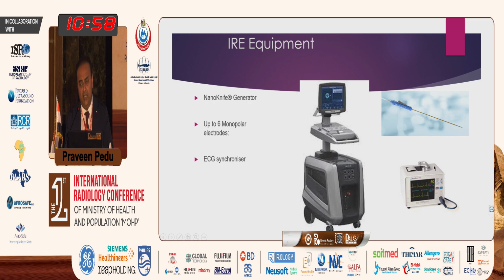And because we are treating tumors in an organ which is very close to the heart, you have to synchronize the electric pulse delivery to the heart rhythm, otherwise you will cause cardiac arrhythmias. So that's why the ECG synchronizer plays a role here.